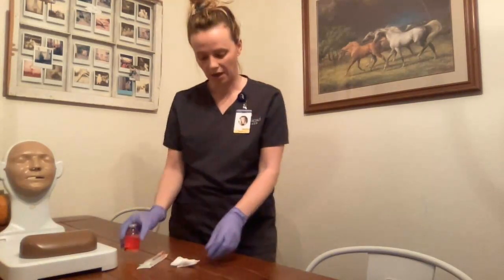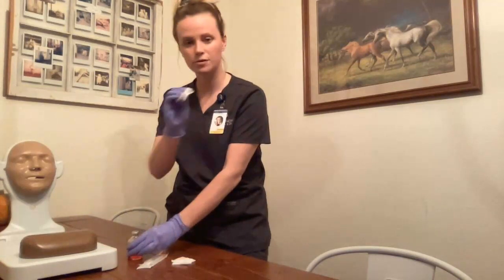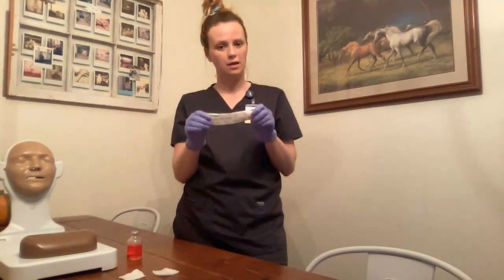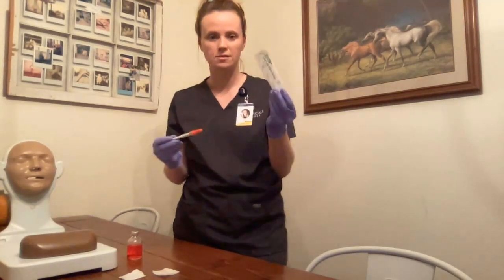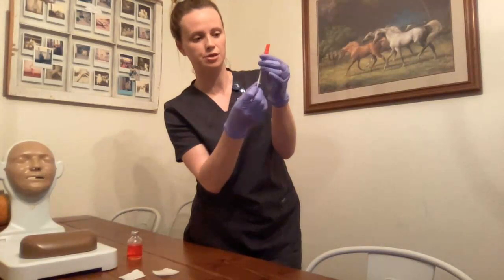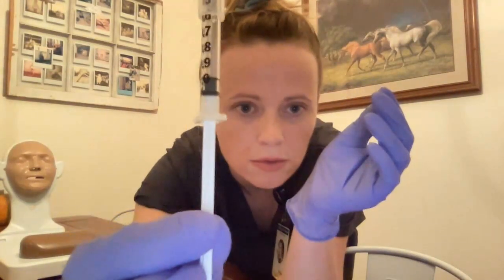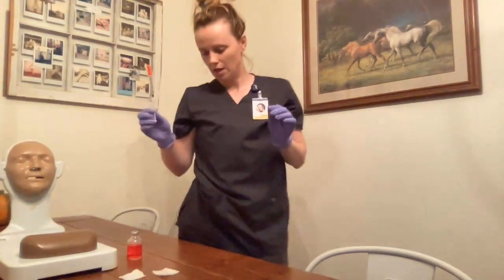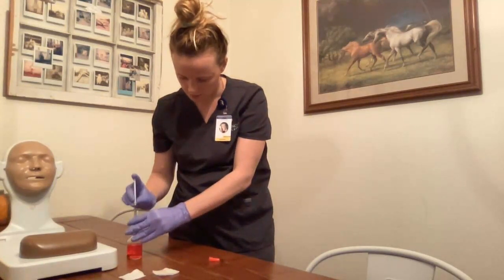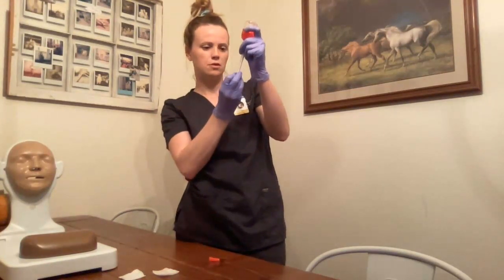To start off, I'm going to get my medication vial and alcohol wipe. I'm going to clean the top of the medication vial, then dispose of this in my trash. Next, while that dries, I will draw up the appropriate amount of air — again, one milliliter. Holding like a pencil, needle up, cap on, draw the air into the syringe. One milliliter. Then, using two fingers, I will remove the cap, inject into the medication vial, administer the air, invert, and draw the solution to one milliliter.